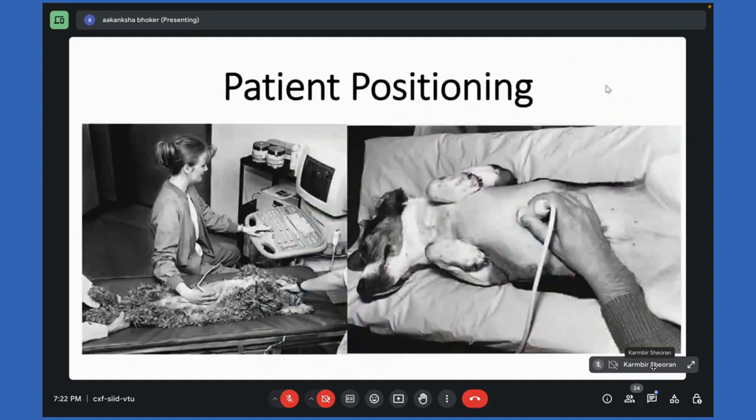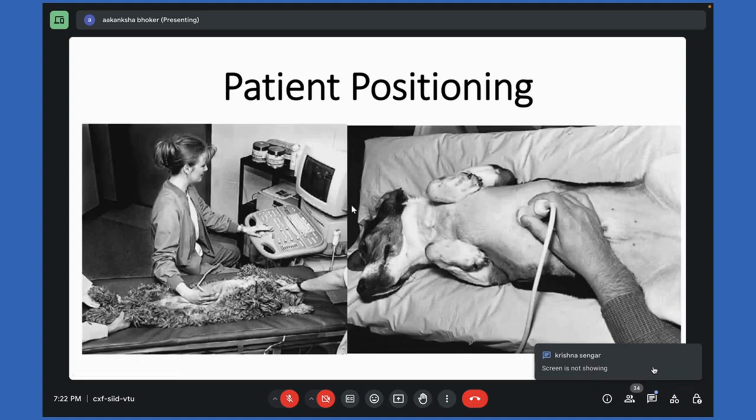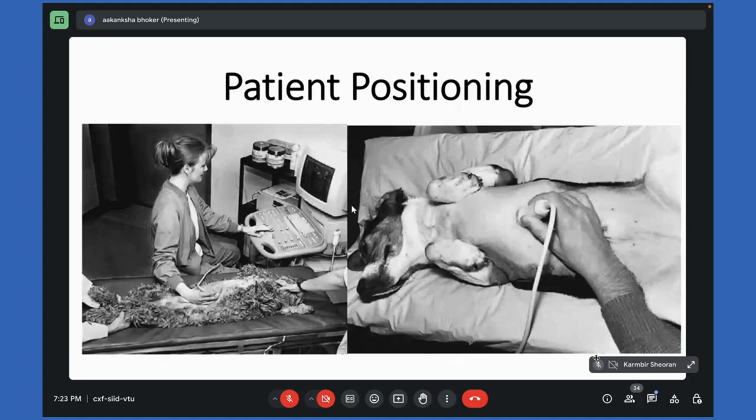Then a very important thing is patient positioning. Mainly most of the people are right-handed, right? So I will tell this for right-handed persons. The patient should be on the right-hand side so that you can use the probe in your right hand to scan the entire abdominal area. The head of the patient should be lying cranially, away from you, okay? And the machine should be in front of you.